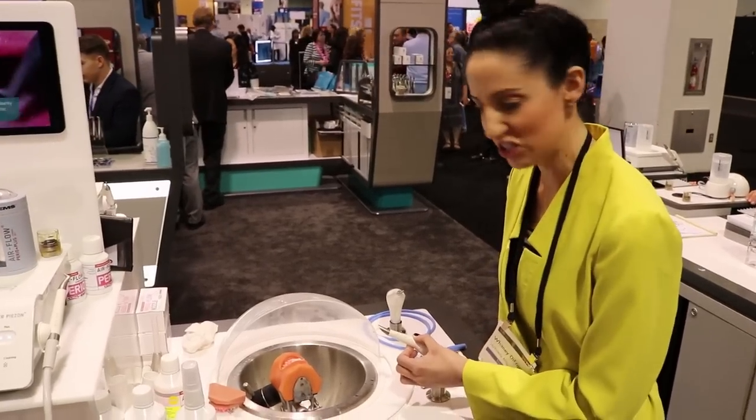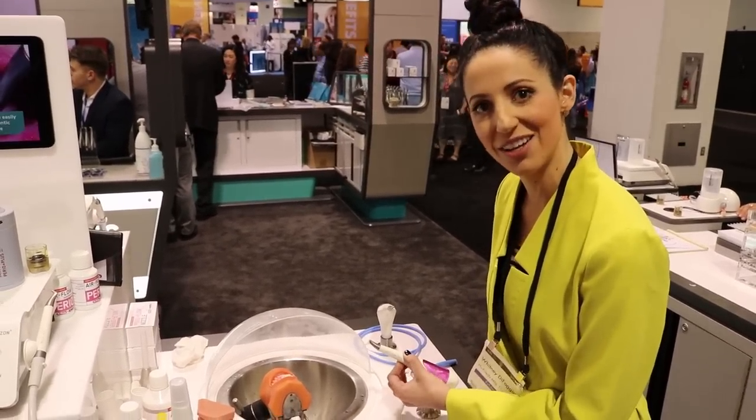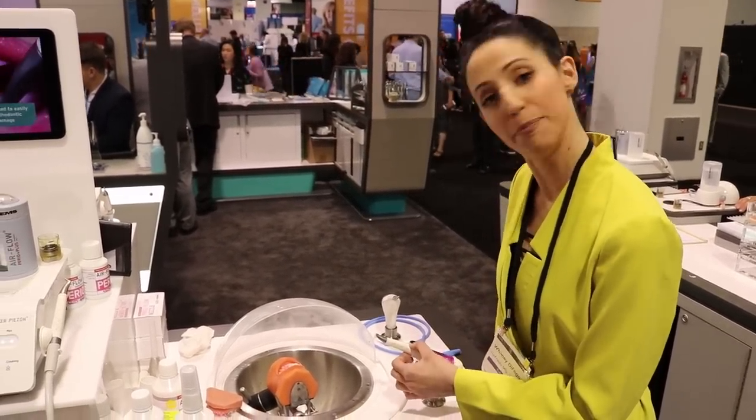We have Airflow, which is an amazing air polishing technology. You can polish sub-G — subgingivally. So that's pretty cool.